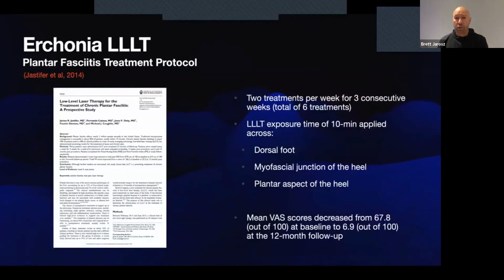Plantar fasciitis treatment protocol. Again, we can see here it's a 10-minute treatment application, 2 treatments per week. And you're going to see this is a bit of a common thread that a lot of the treatment protocols tend to be about 2 treatments per week. So this one here was 2 treatments per week for 6 treatments. And all they did was 10 minutes. And this was wanding again.